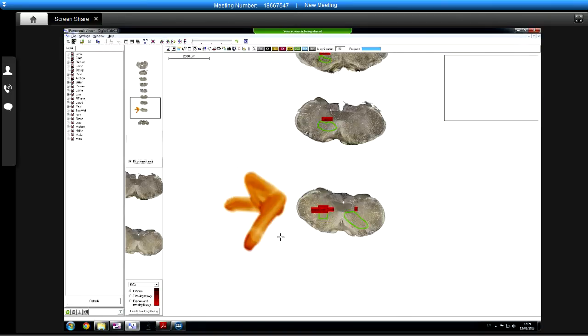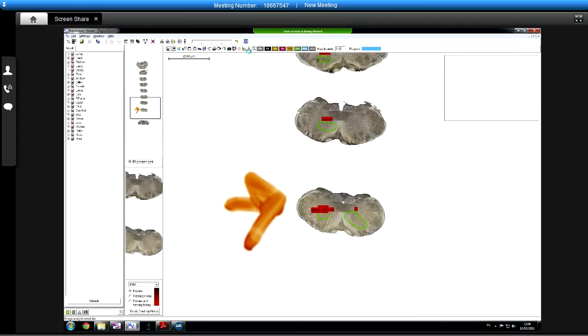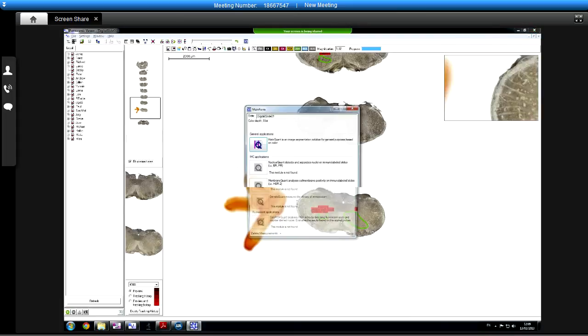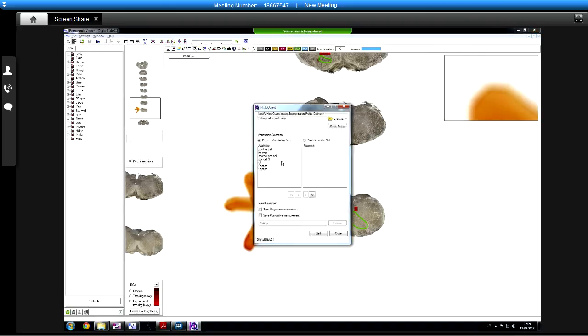So if you're just processing on one slide, you can just go back in where we were before, and just say I want to do that one, that one, that one. Say I just want that one, and run it, and it will run on all those areas. Or I spoke about batch processing before, which is where you've got multiple slides. So we can sort of pretend this. So say, we haven't got it here. You need to have it here.